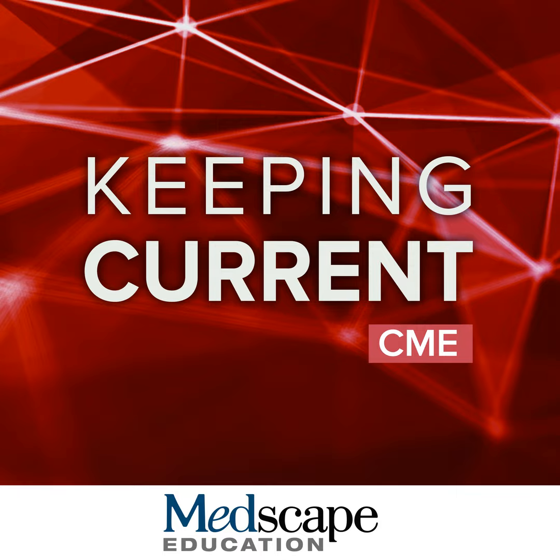And when we look at diffusion and hepatobiliary phase, notice that the lesion on our left actually is hypoenhancing on hepatobiliary phase, confirming that this is a true metastasis, as opposed to the lesion on our right. You can see it's isoenhancing, so that is FNH, and now we can distinguish these entities.